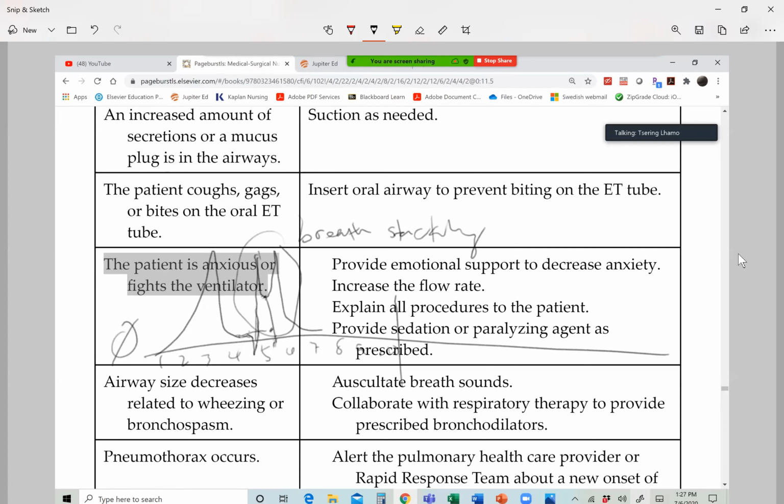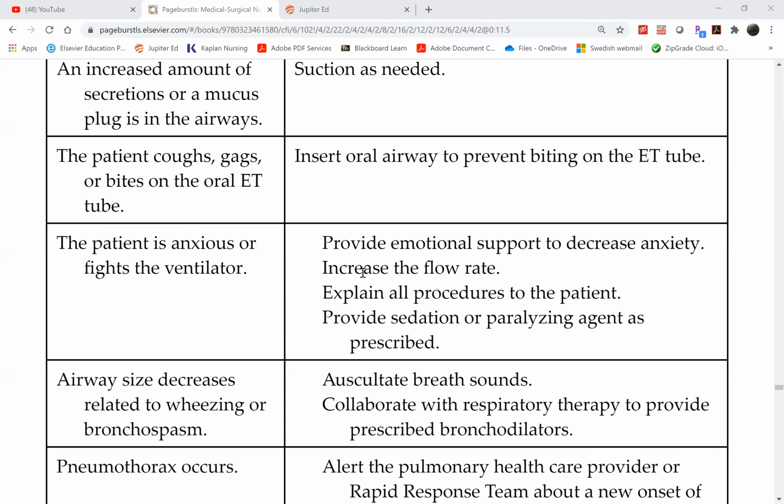And so on. Here, airway diameter does change because the presence of the airway, it's a foreign object, right? So of course it will trigger some inflammatory response around the trachea. That will cause some inflammation and swelling of the trachea. So that may decrease the size of the airway now, because the bronchial wall will thicken because of inflammation. And that may cause some obstruction, triggering the high pressure alarm.